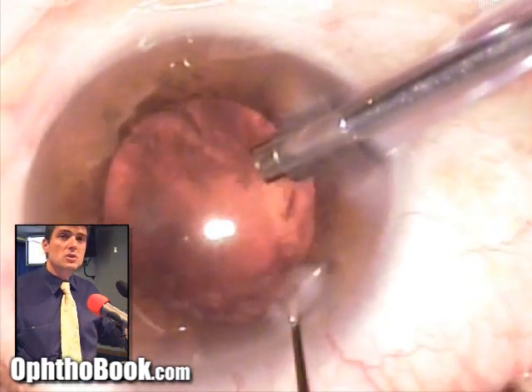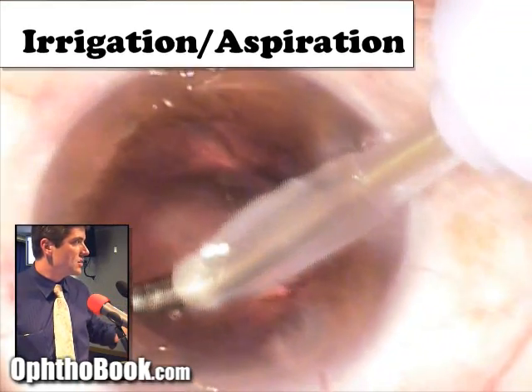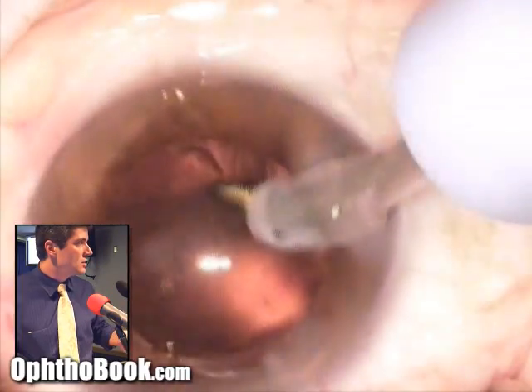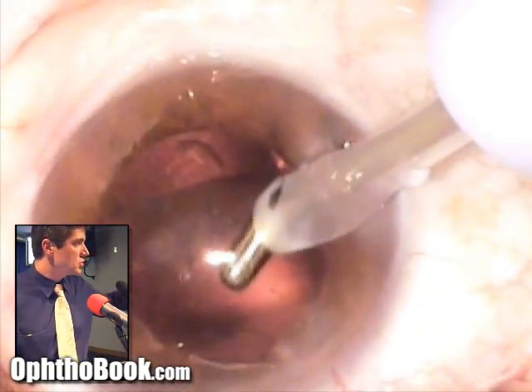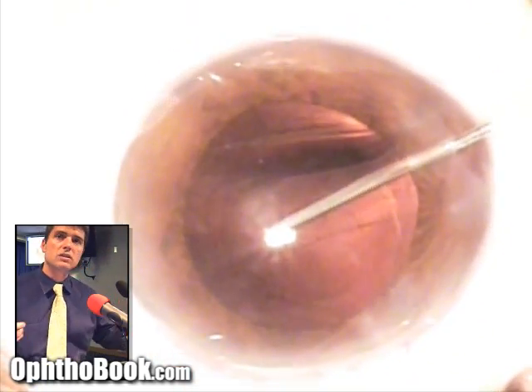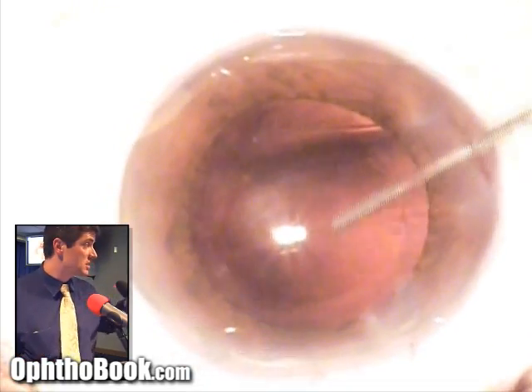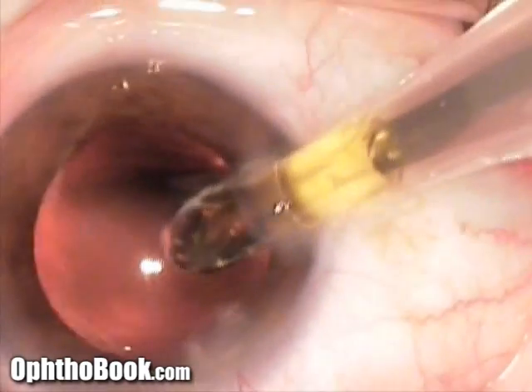We've gotten all of the nucleus out, but there's still cortex remaining — the chocolate layer on the inner surface of the capsular bag. You can see debris on the inner bag surface, so we go in with irrigation and aspiration to pull those clear jello-like pieces of cortex out, because leaving too much can cause inflammation. The sub-incisional cortex is always the hardest — I have to turn the instrument upside down to reach behind the incision. Once that's clean, we put in a little viscoelastic to inflate the capsular bag and create a nice pocket for the lens.